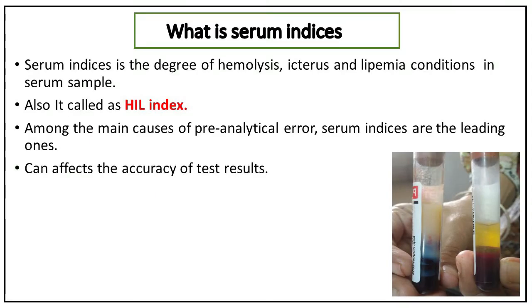What is serum indices? Serum indices is the degree of hemolysis, icterus, and lipemia conditions in a serum sample, also called the HIL index. Among the main causes of pre-analytical errors, serum indices are the leading ones and can affect the accuracy of test results.